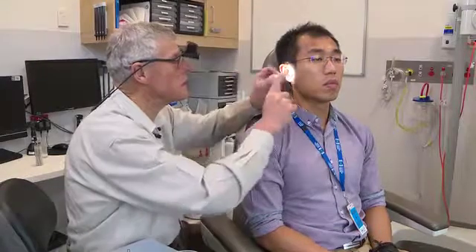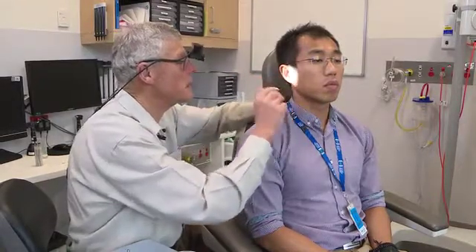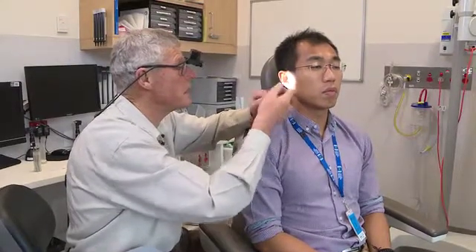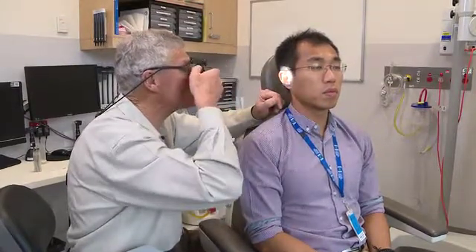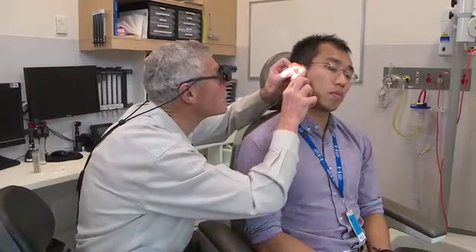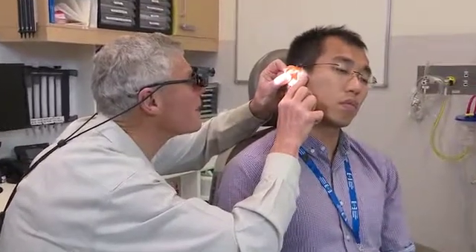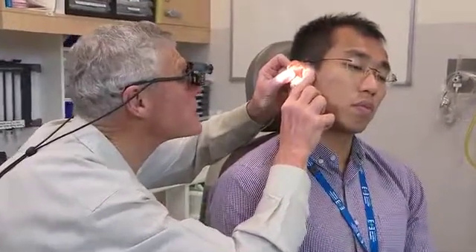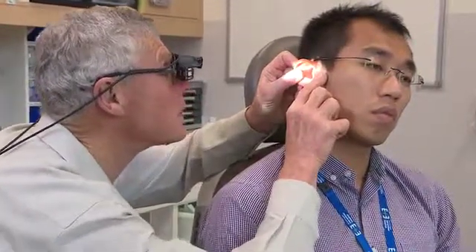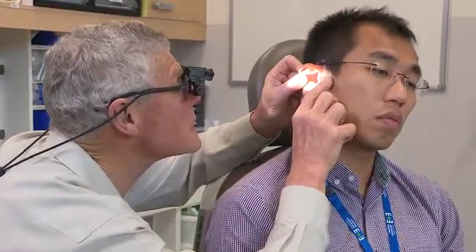If you want to not just look, but instrument as well in an ear, you can't use a handheld with any success, and probably something on your head is a good option. This way I'm going to be able to get a good look straight away at the eardrum with both eyes — open one eye, open the other eye, both eyes are down the hole. That quick look will tell me there is a healthy looking eardrum with a light reflex, and I can see the full length of the malleus handle.